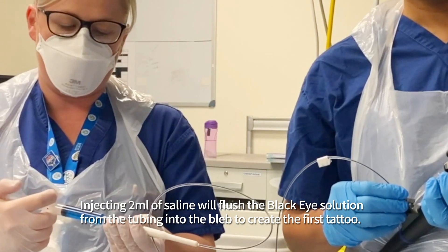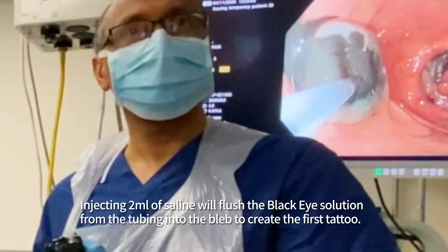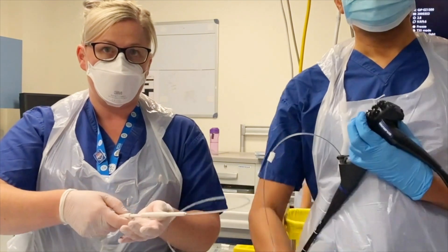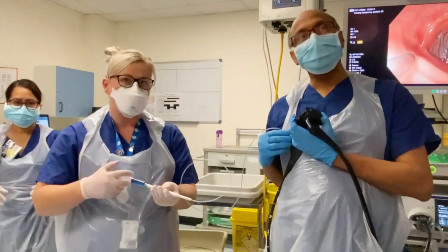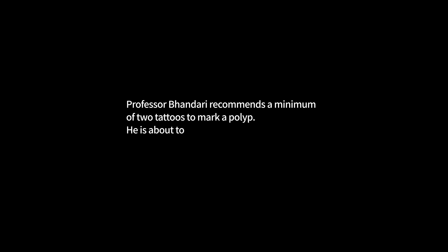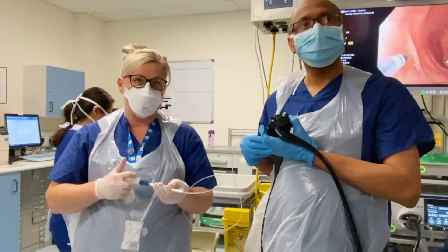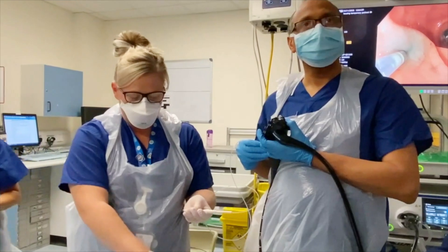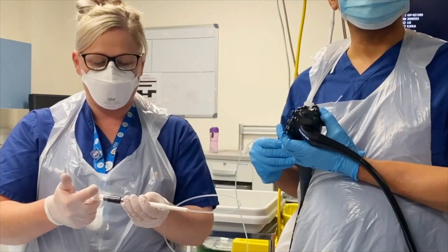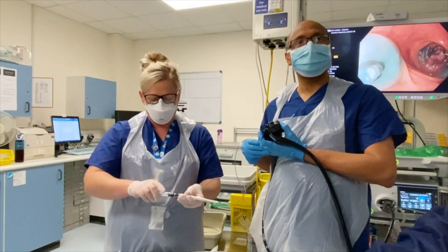Inject 2 ml. Now we'll do exactly the same tattoo on the other side. Can we empty the catheter first? Yes, inject so that we get all the tattoo out. Inject please — stop — and change the tattoo. Okay, change over and flush another 2 ml with the flushing solution.